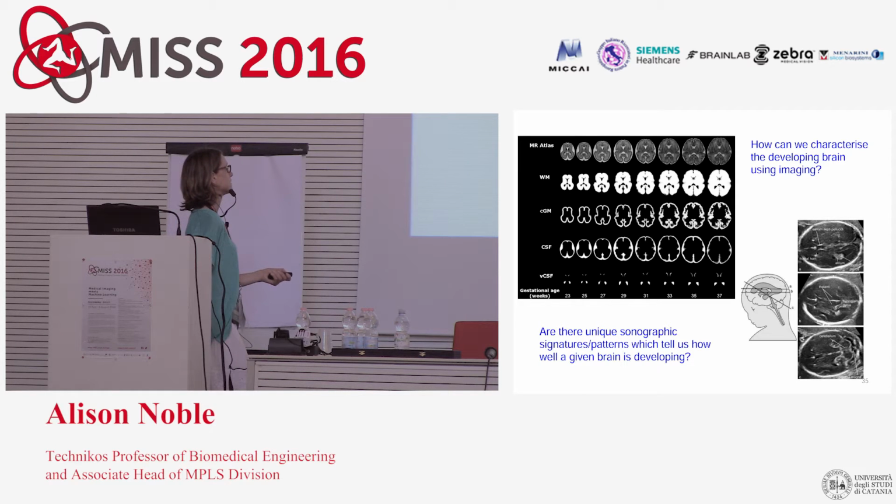It's different. The problems you pose and the solutions you come up with are going to be totally different. Why you want to do it is that if you're going to be working in clinics and pick up neurological delays, neurological conditions, you need to be able to get solutions that work on ultrasound.